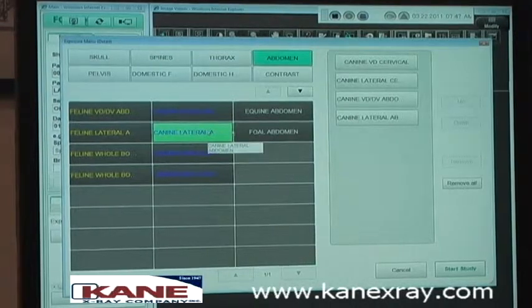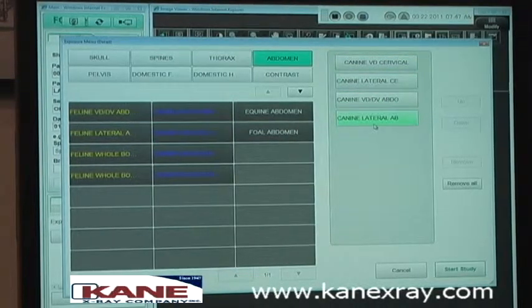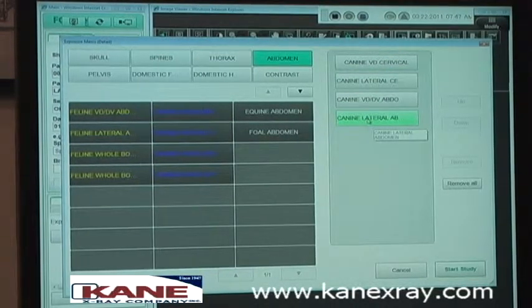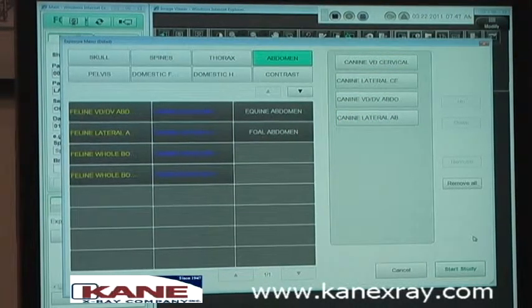After you have all your exposure menus selected, you then go down to the bottom right corner and click Start Study.